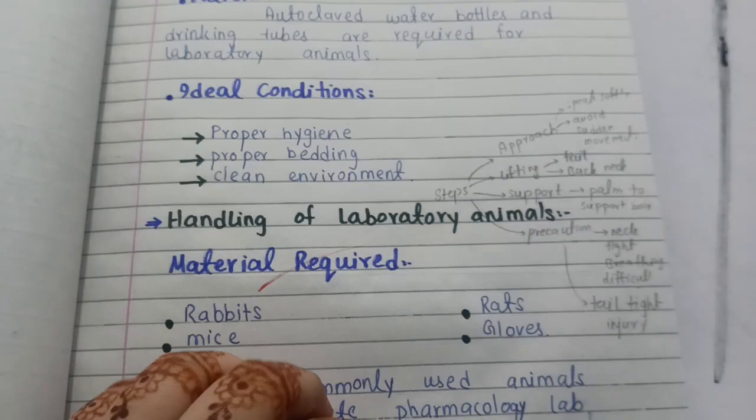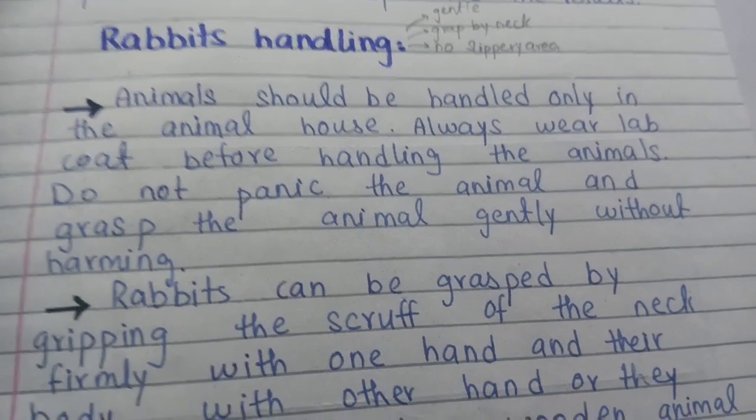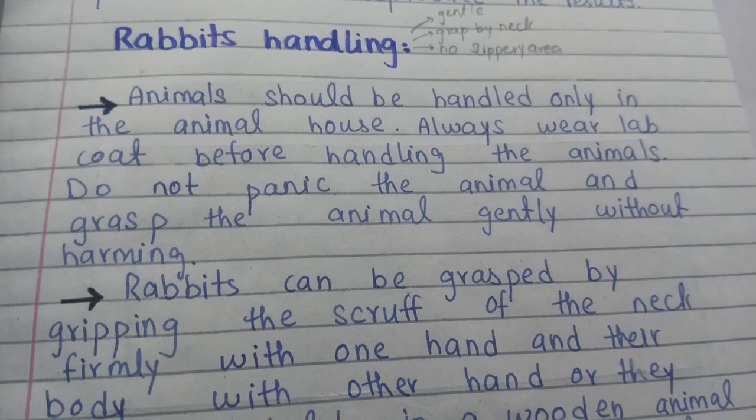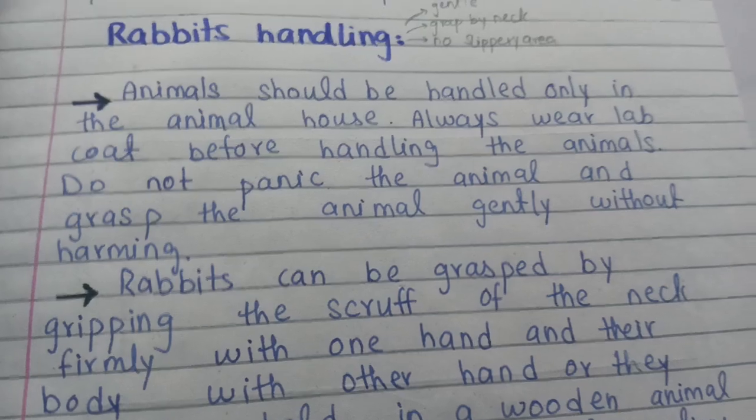So first of all, let's study about rabbit handling. You have to handle them gently, and second thing, you have to grab them by their neck, and make sure there is no slippery area.